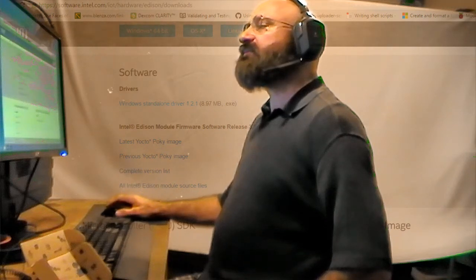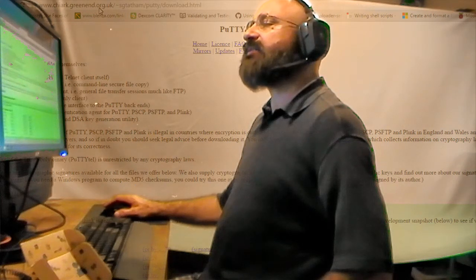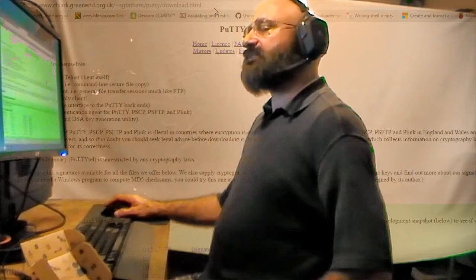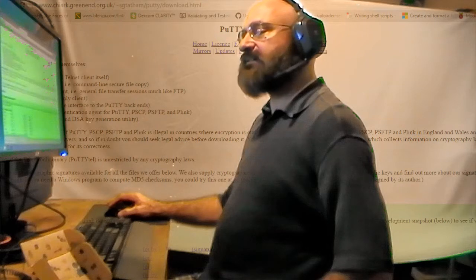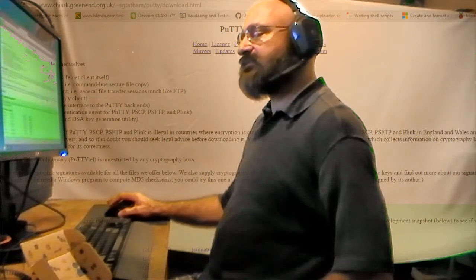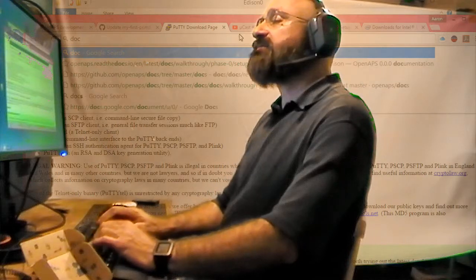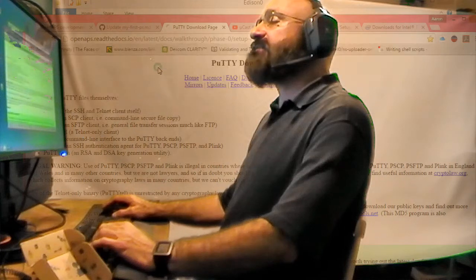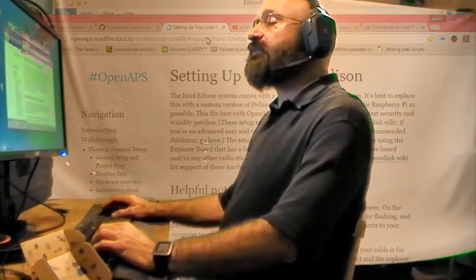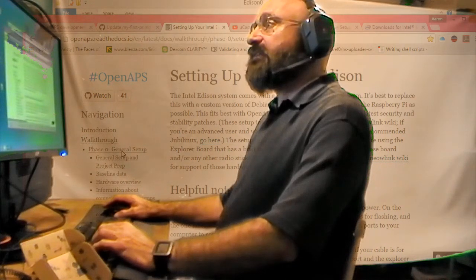Now we also want this PuTTY. See, from chiark.greenend.org.uk PuTTY download page. This is the PuTTY download page, and we want putty.exe. So you click on here. That didn't take long. So this time, let's open docs. See, it's open apps, read the docs, latest docs, walkthrough, phase 0. Okay, so yeah, that's what we need.